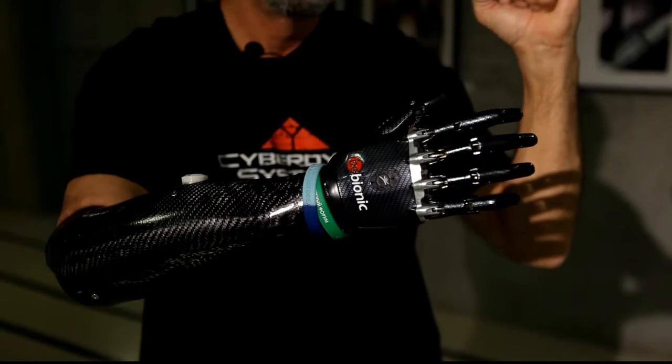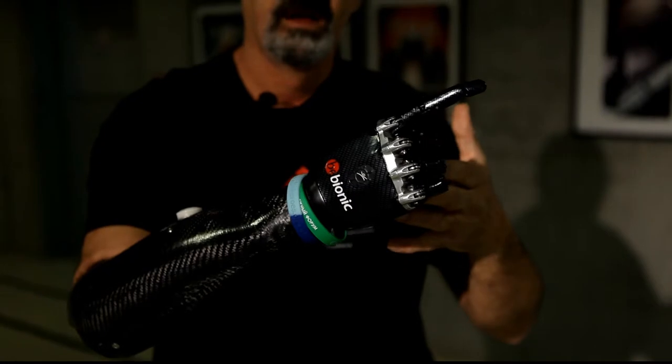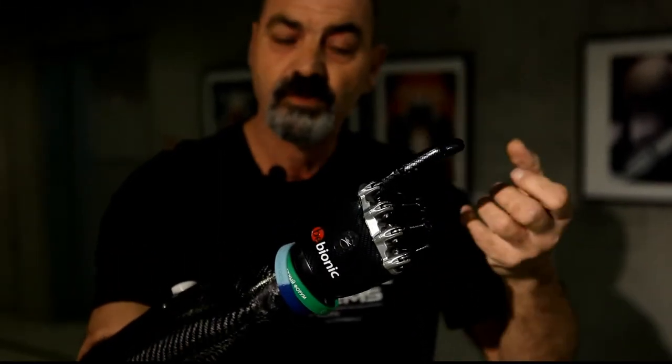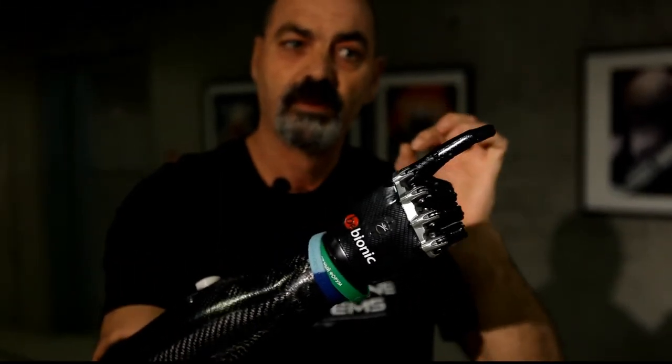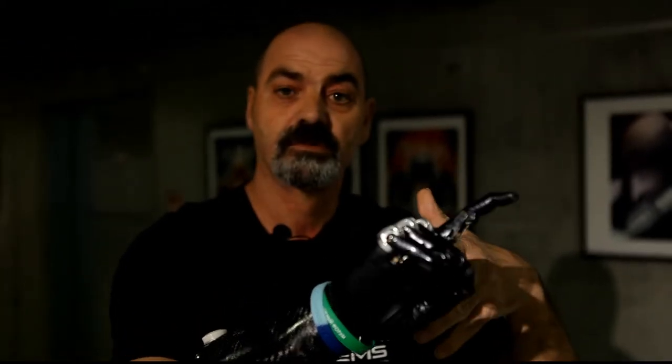If I do this movement, the hand will close. And then if I do this movement there is a small beat, and now if I close it will turn this way, and if I open it turns this way. And if I want to show off, it goes all the way.